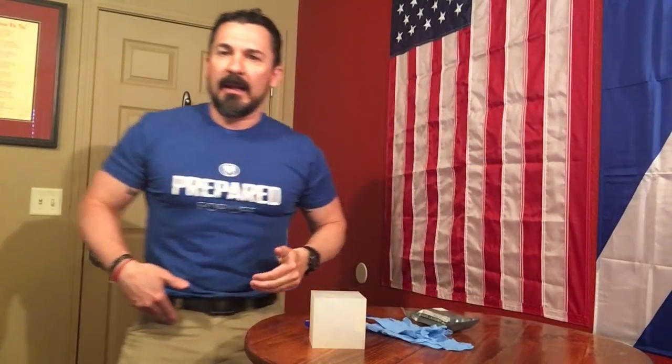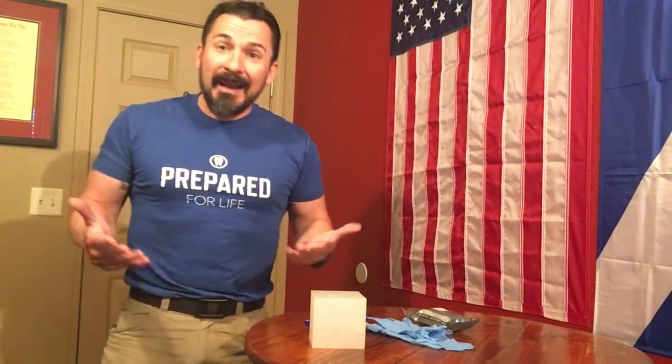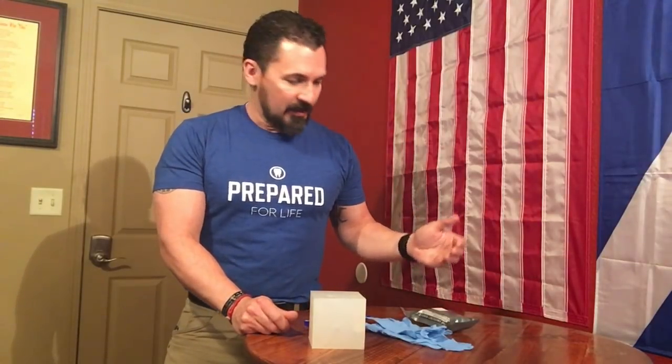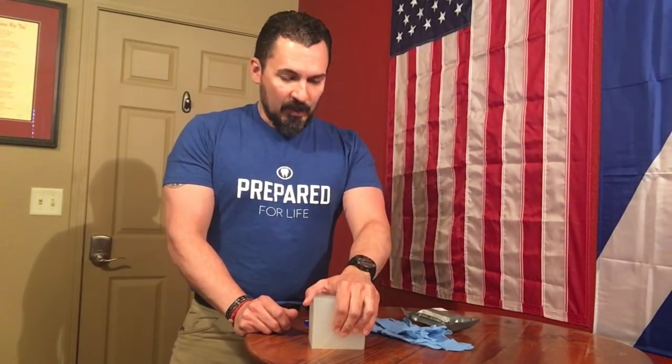Why do we want to pack a wound? Well, we want to pack a wound to put a hemostatic agent into it to stop any kind of life-threatening bleeding. And where would we pack a wound? We would typically pack a wound in what we call the junctional areas of the body, which is to say the junction where the neck and the shoulders meet, up under the armpits, and down here in the groin region. Areas that we can't put a tourniquet on. So that's what we're looking for initially, areas not amenable to tourniquet use. So that's where we're going to put this wound packing material.